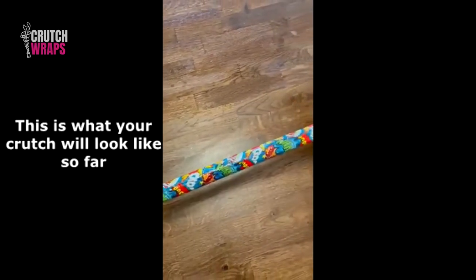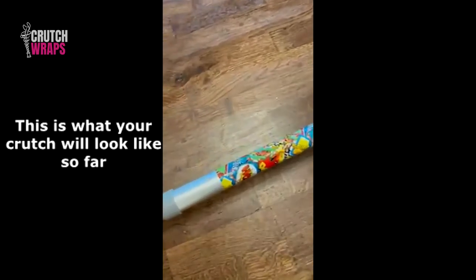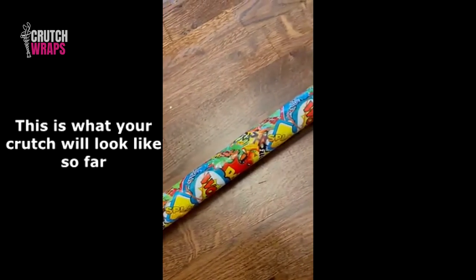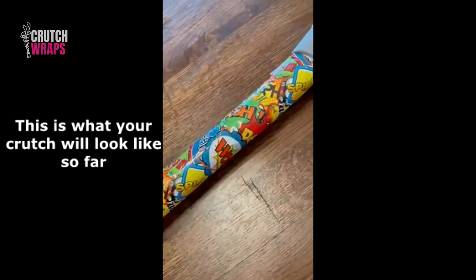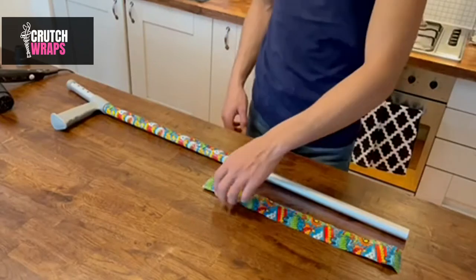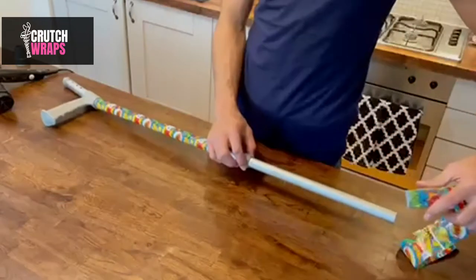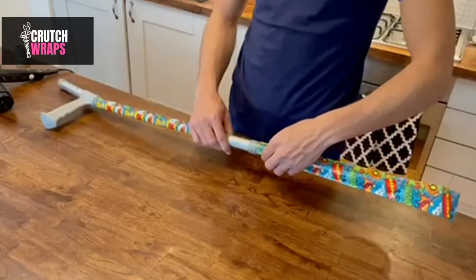This is how your crutch should look so far. Step 5. Apply the second sleeve and align it with the first until you are happy. We recommend you overlap the sleeve slightly, and now do the same again with the strap as you did the first.